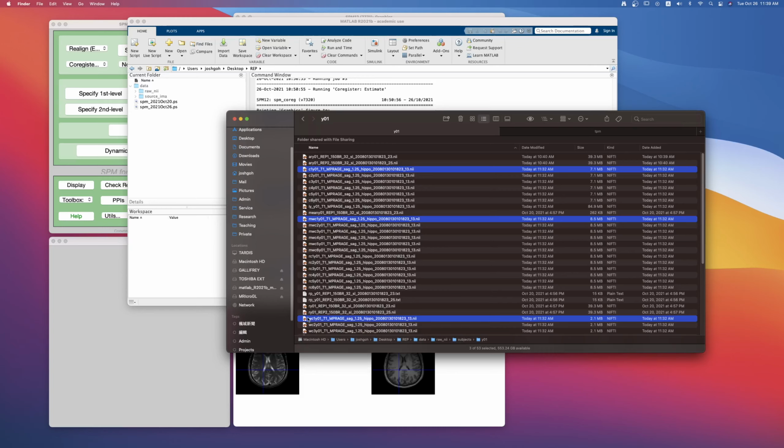And then this is not modulated. Remember we talked about modulation, if you change the shape, you might change the intensity to indicate changes in density of the brain tissue, and that would be the modulated case here with the M in front. So this would be the unmodulated. You only change shape, but you don't change the numbers. Okay, so you lose that information.